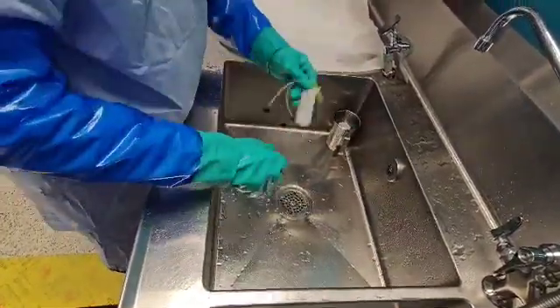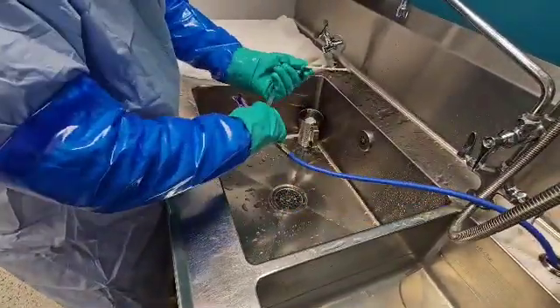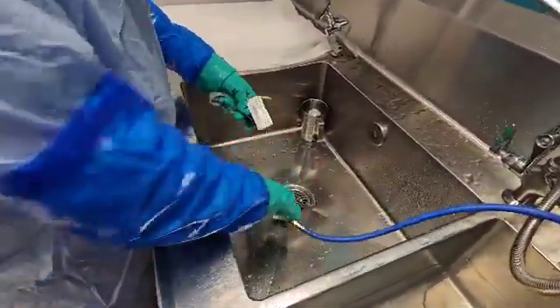After rinsing very well, you're going to go ahead and dry your device, and this is how you process an accessory. Alright guys, till next time.